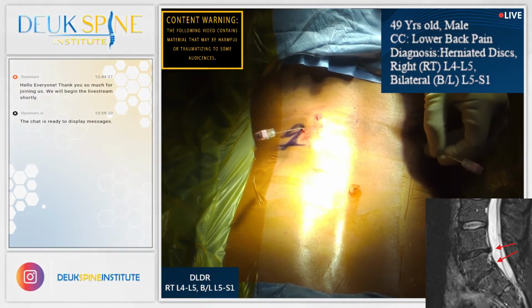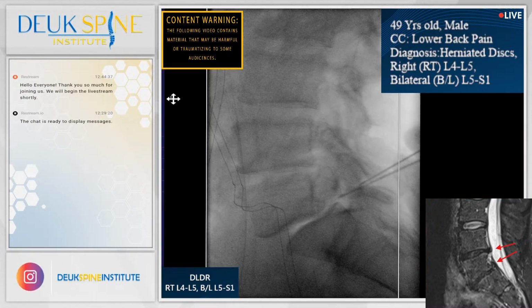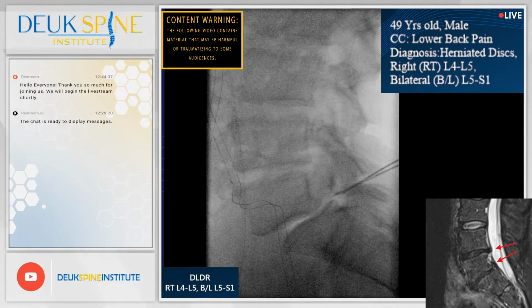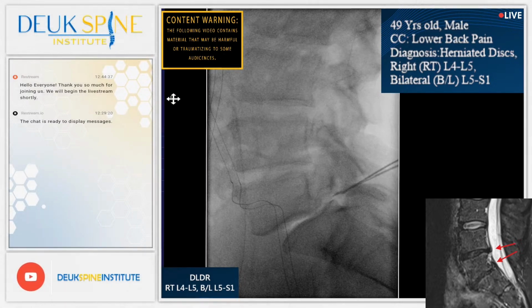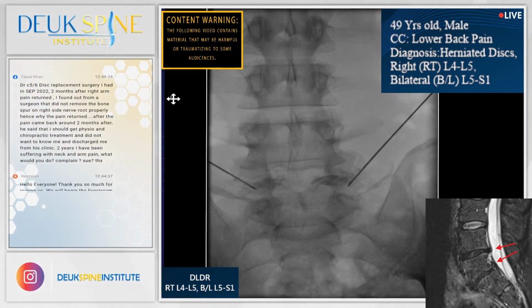Questions, just stay with us. Doing great, doing really well. See if he has any pain. Are you having any back pain right now? Not right now. Any pain at all? No.